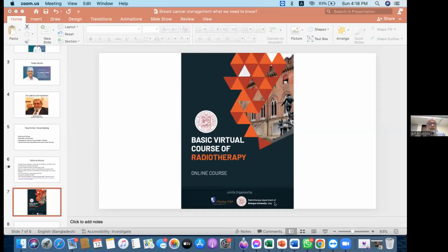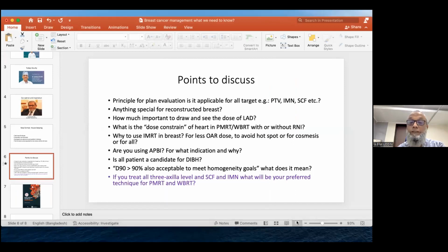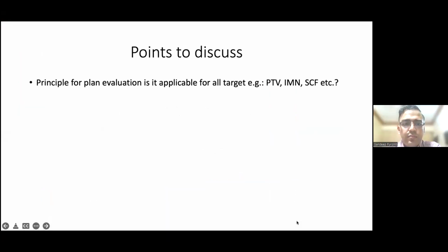If DIBH is not available, which technique is preferred for left breast irradiation? You can cover, yes, sir. I will pull out the question that I was keeping for sharing with you. So let us start with this question. If no DIBH, for left-sided breast, what is the preferred technique?